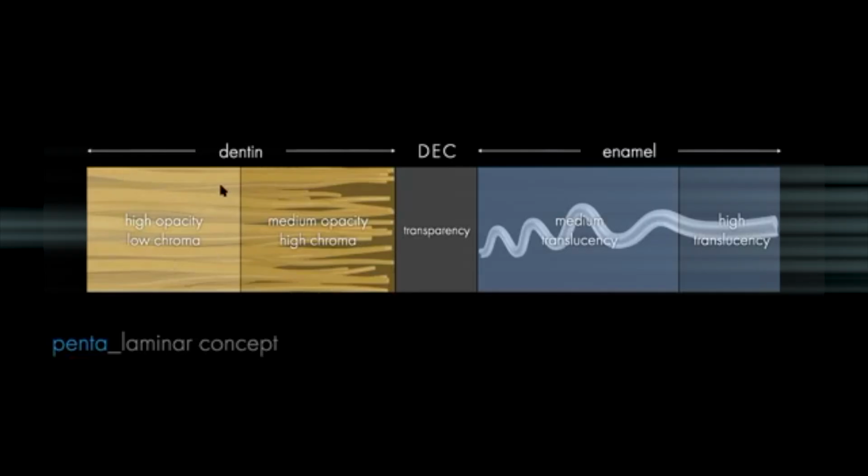So this model, which maybe you can find in some publications in the past, not exactly as this but maybe more similar, is completely different in the way we apply it, because we need to adapt this also to the age of the patient, as we will see in a moment. And this is a concept, which means that it can be simplified. If I analyze the difference between the outer and the inner enamel, it's not very strong. So we may be able to just use only one enamel to copy this, okay? And we can avoid using two enamels.